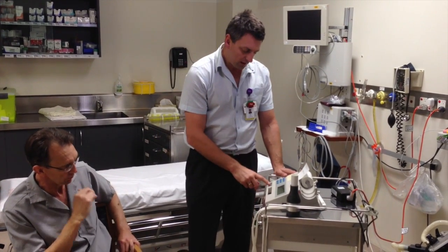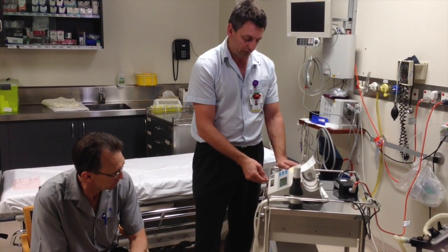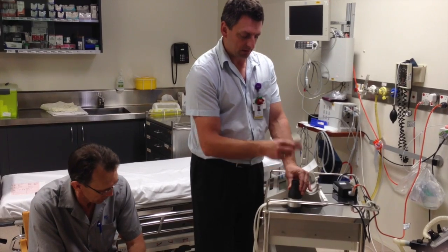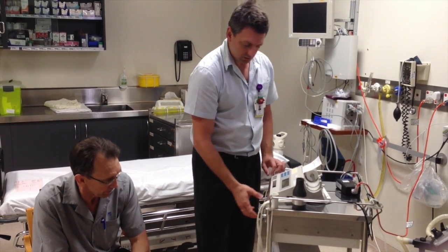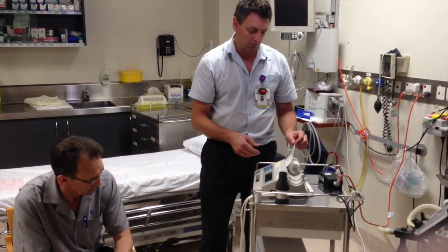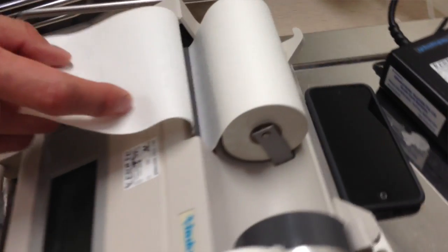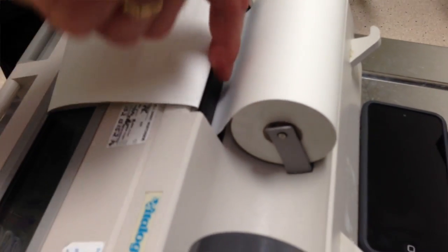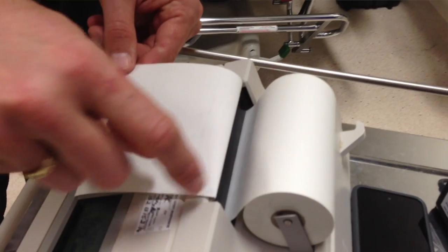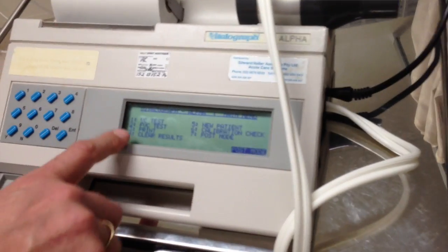Things to note: this gray little box here — do not pull that out when you're starting or halfway through because all the data gets wiped out. Dispose of the mouthpieces in the bin after each use. New ones are in the top drawer if you need them. To put the paper in — you have to fold the paper over the top and feed it into the bottom hole of the black plastic, then it comes out through the top. You have to go through all the patient data and then the printer will start ticking around — just let it feed through. It does take a bit of time.